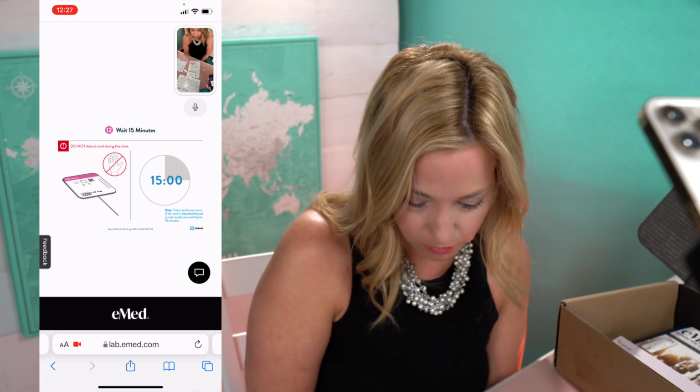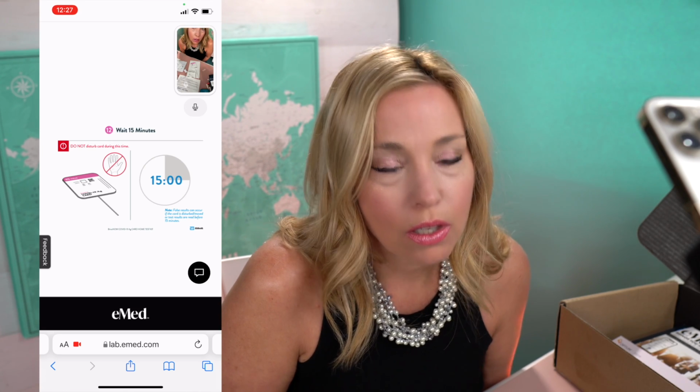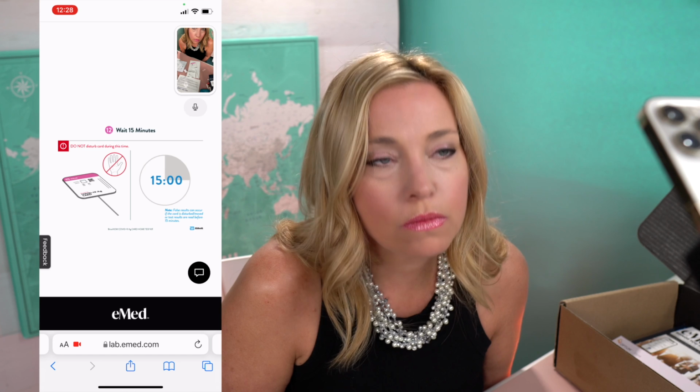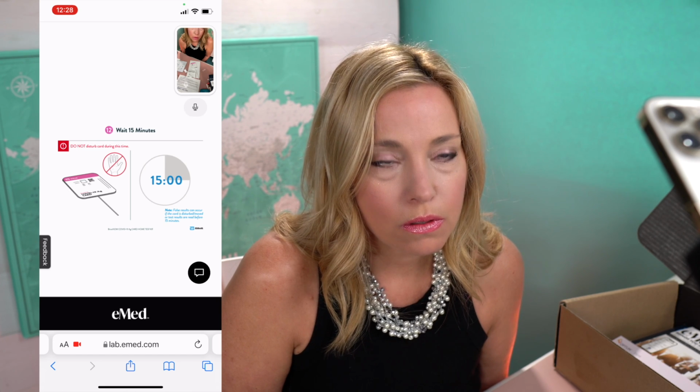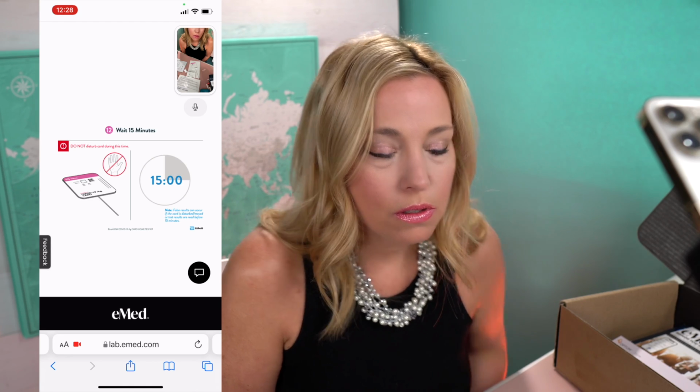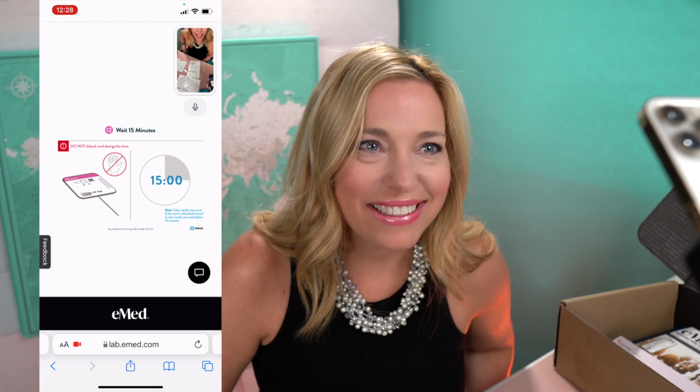In a moment, I'll activate your timer. The test must stay flat and stationary. Don't touch the test during this time. Okay. At Proctor, we will be helping you in 15 minutes with the results. You are free to move away from the screen, but make sure you're back before the 15 minutes are up, okay? Yes. Great. Okay.